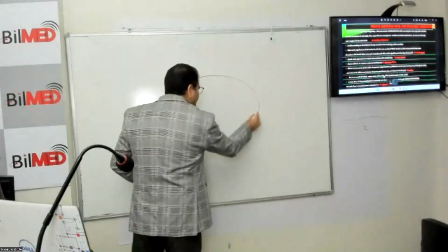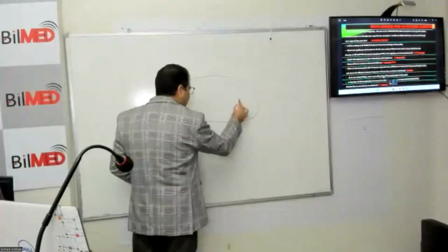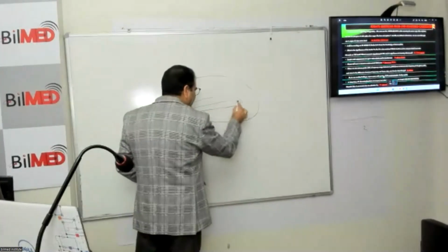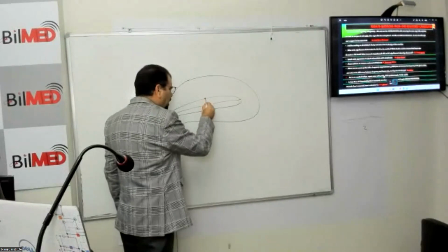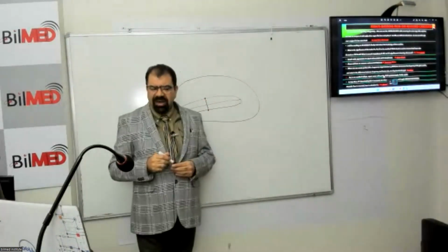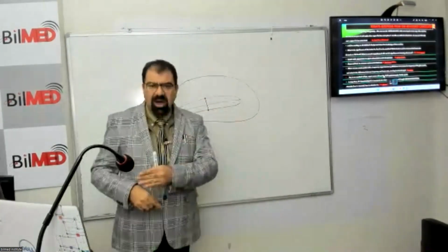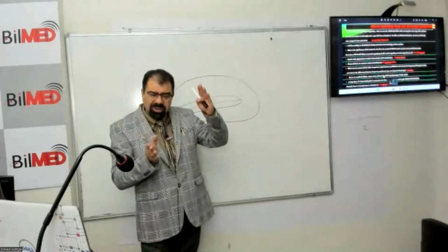So just a brief. This is the uterus. I am having here the endometrium. Endometrium is having, for example, in this case, a triple line. You have to measure from outer to outer, not inner to inner, outer to outer. So it is actually from the endomyometrial junction from one side to another side, including both endomyometrial junctions. So it is from the outer to outer.